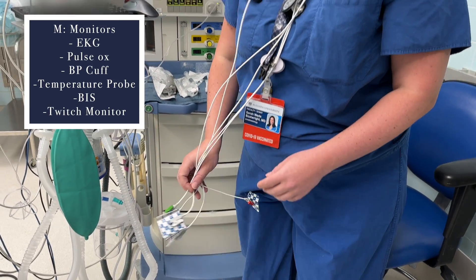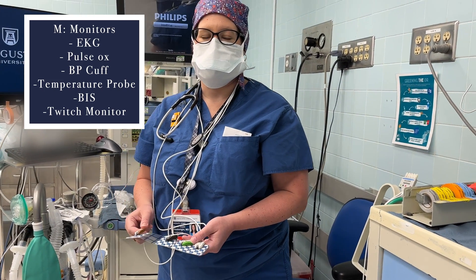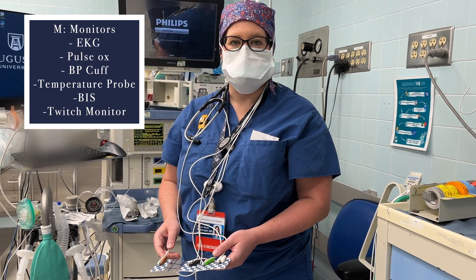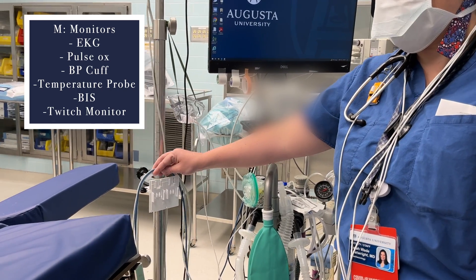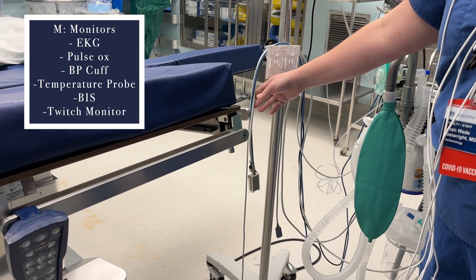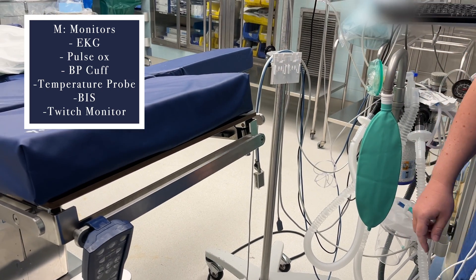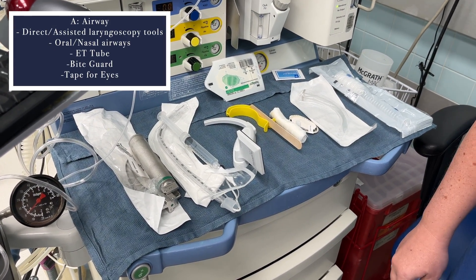Our next letter is another M for monitors. We typically start with the EKG leads, which I have around my neck because I'll be placing them on the patient in holding before they come back into the room, just to save time and be more efficient. Other monitors you want to have readily available — with cables right next to the bed — are your oxygen saturation monitor, blood pressure cuff, cardiac monitor, and a temp probe.